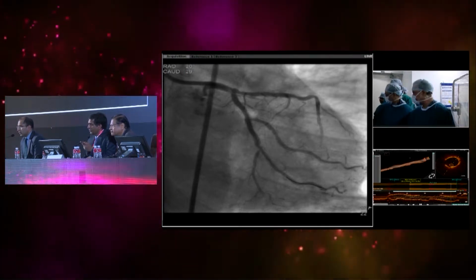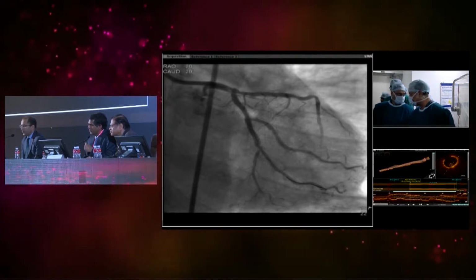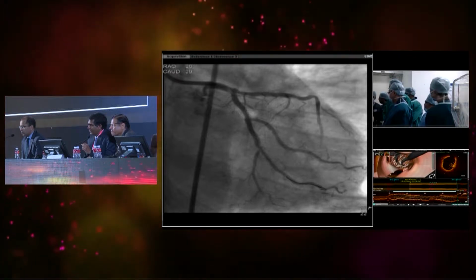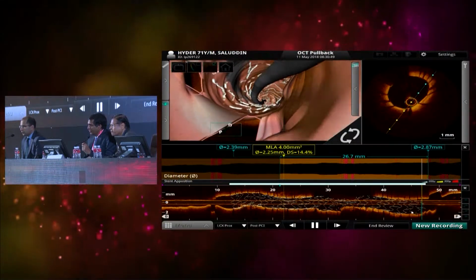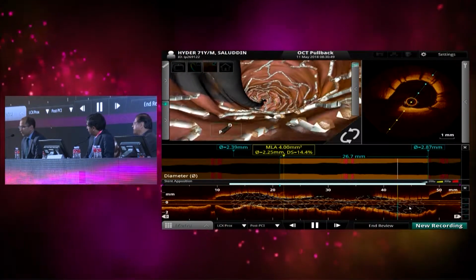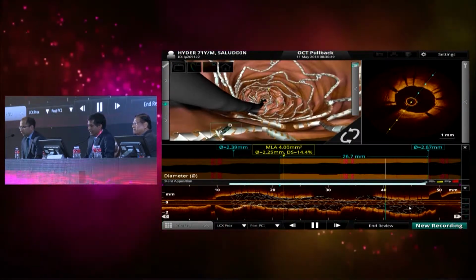It looks like they cannot hear, but what Dr. Kirtane is saying is right. You cannot measure from the lumen itself and decide on the stent size compared to IVUS. Then you might actually choose a smaller stent. Is that right, Ajay?